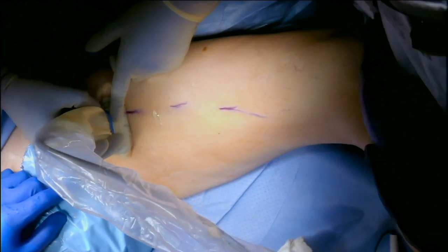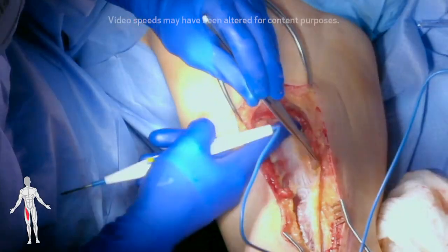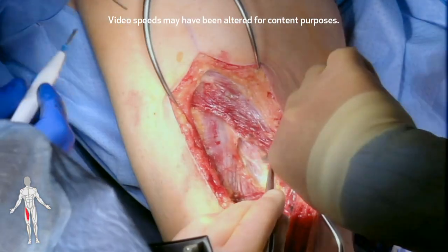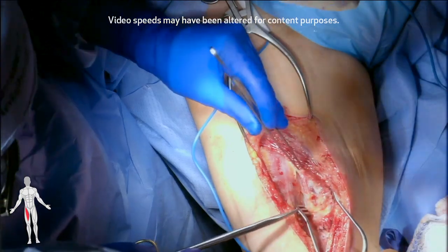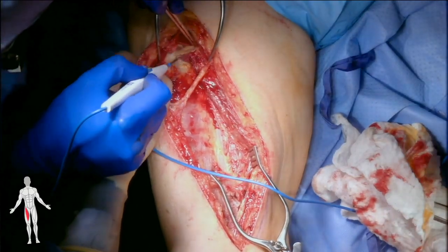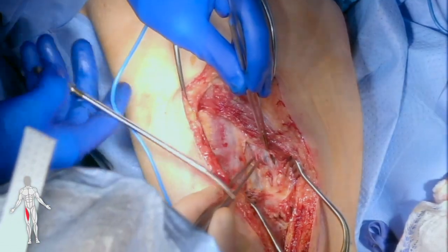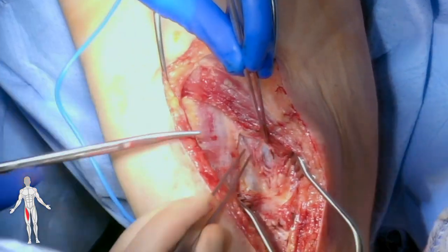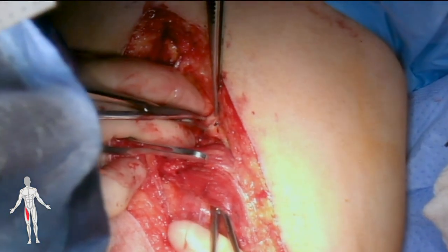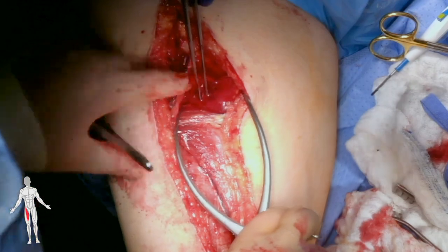During the first stage of the operation, two teams are employed and tasked with harvest of the femoral vein from each thigh. Ultrasound is first used to localize the vein. Incision is made along the lateral border of the sartorius muscle, extended superiorly towards the ASIS and inferiorly towards the femoral condyle. The sartorius is then reflected medially with caution to preserve its blood supply. The subsartorial canal is entered with exposure of the femoral vessels. Care should be employed to avoid inadvertent injury to the femoral nerve. The femoral vein is then dissected more superiorly.